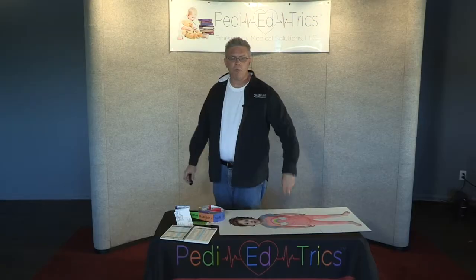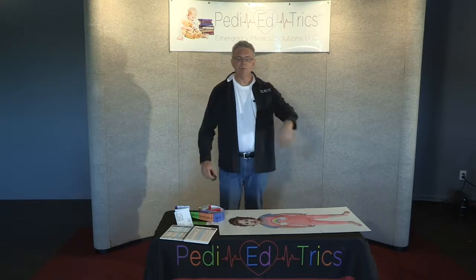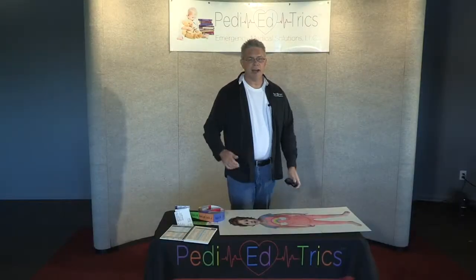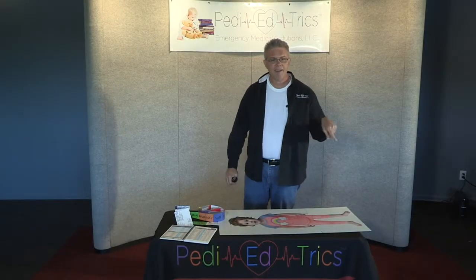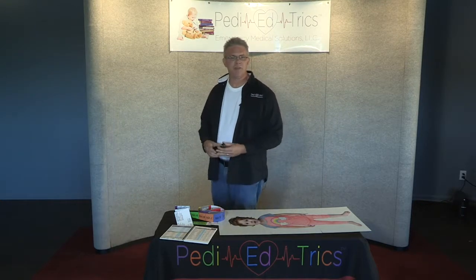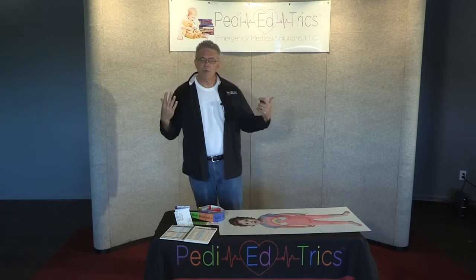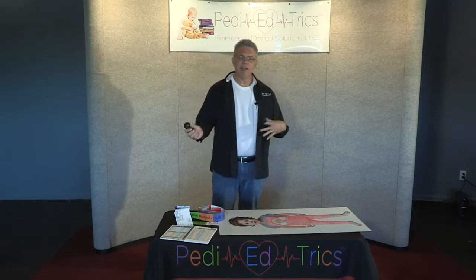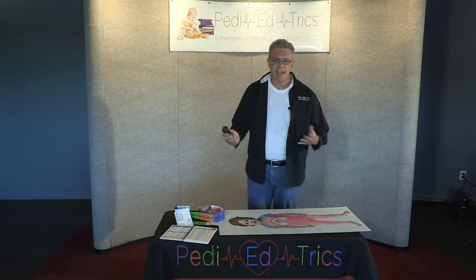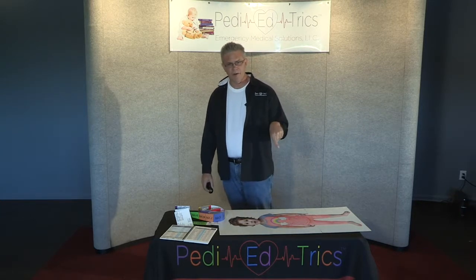Now, IVs. Where are you going to put it? Anywhere. What size are you going to put in? Anything, except if you're an honest ER nurse or a paramedic. Because honest ER nurses and paramedics on the adult side will tell you that everybody has to get an 18 gauge. And somewhere along the way, it was taught to many of us that if we try to get blood through anything smaller than an 18 gauge, it's going to hemolyze. And that is not true.